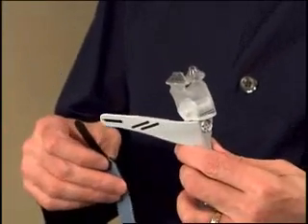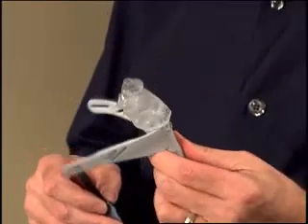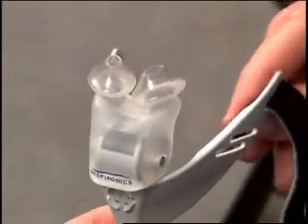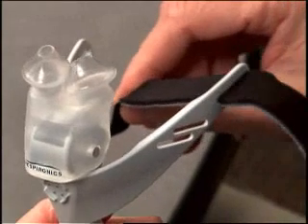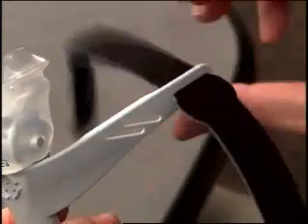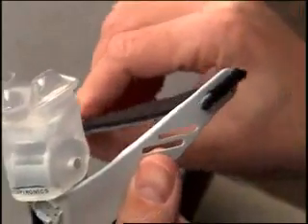To attach the chin support band, hold the interface as you would place it on your face. Into the horizontal slot on one side of the interface, insert the end with the thin black headgear tab with the blue surface of the band facing down. Insert the band from the outside of the interface to the inside, and pull the band completely through to the end.